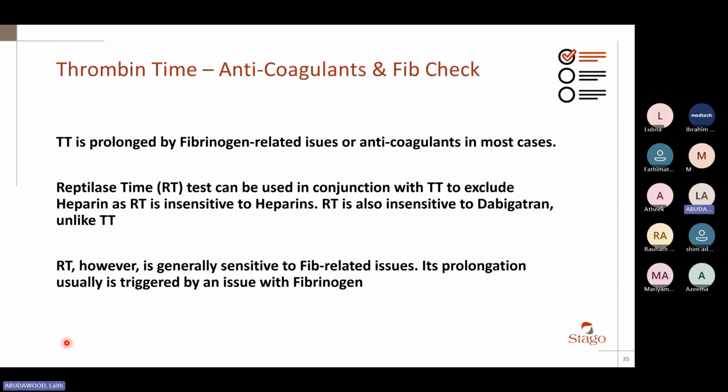Okay. Yes, thrombin time. Now, if you remember, I told you thrombin time can be prolonged if you have heparin, if you have thrombin inhibitors, or if you have a problem with fibrinogen, or if you have fibrin-fibrinogen degradation products. Okay, so the breakage of the clot will produce fibrinogen degradation products in high amounts. These can interfere with thrombin time. Anyways, if thrombin time is prolonged, how can we say it's a fibrinogen issue or a heparin issue? All of these issues can cause a prolongation of a thrombin time.